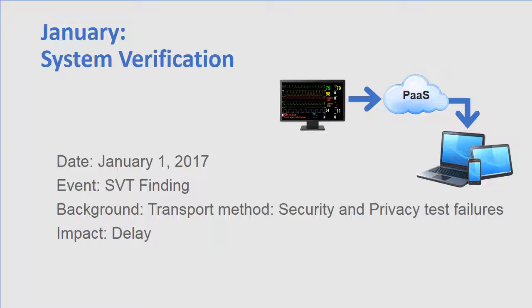Since patient data was neither de-identified nor encrypted during transport, both personally identifiable information and protected health information are readable in clear text. Furthermore, when the quality team digs in deeper, they find that the open nature of the interface makes the system susceptible to a man-in-the-middle attack. And it turns out that Monitoring Systems, Inc. made the mistake of connecting their device directly to the cloud over the internet using a Wi-Fi connection.